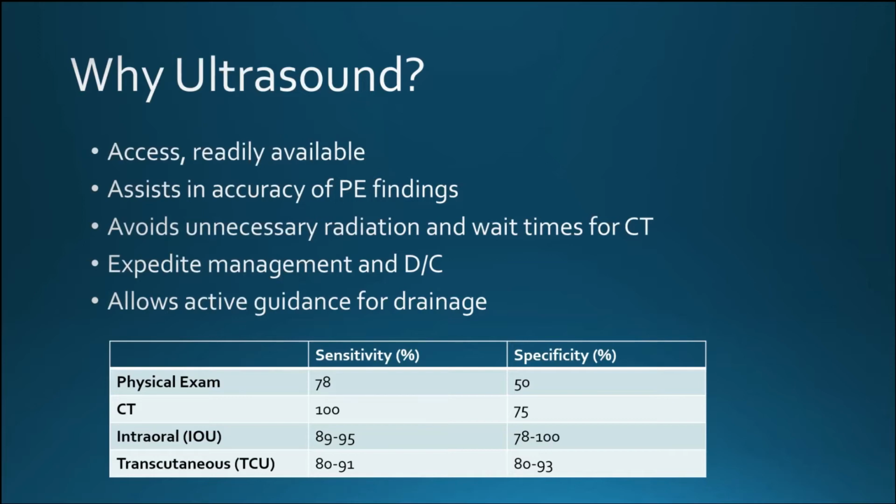Although there are limited studies on transcutaneous diagnostics for this, a few other studies showed that when a patient has trismus and you're unable to get the intraoral probe into the mouth, transcutaneous ultrasound diagnosed 100% of cases. So it shows its utility there.